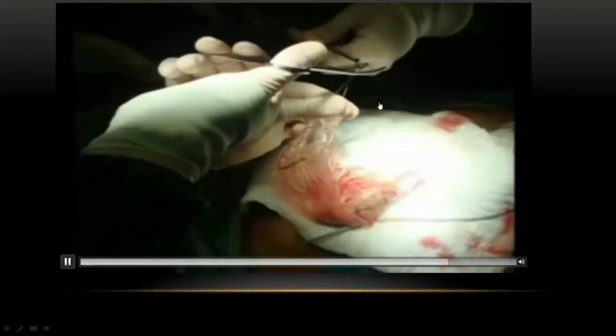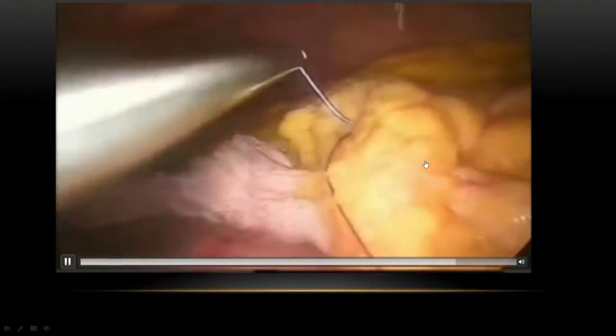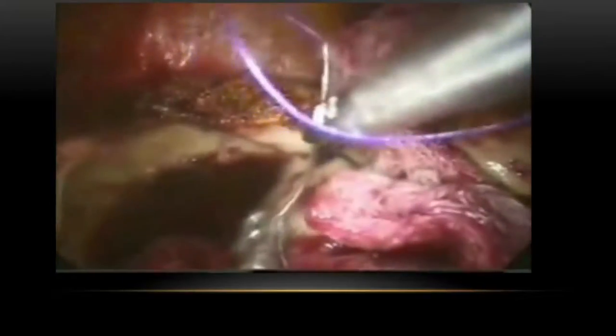This is the endo bag, how it comes out. Now again you will take one gauze piece and it can be pulled out. Now omentoplasty. You can take a bite over the omentum. And then you can push it in and fix it over the surface. Here with the capsule, you can fix it over.